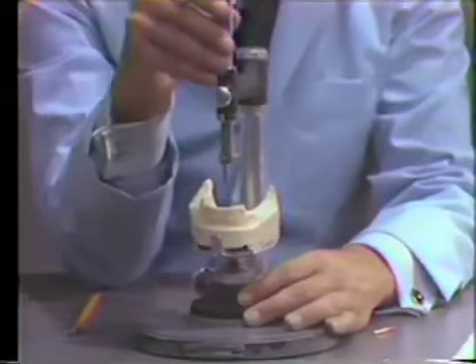Now I'll look around for points that will not change from impression to impression. And areas that I want to look at are probably areas such as the junction of the tooth to the free gingival margin on the cast. That's not likely to change from impression to impression. Areas on the teeth themselves, such as cingulums, etc. Creases in the residual ridge that are not highly movable can also be used. So I'm going to look around the cast for such marks.